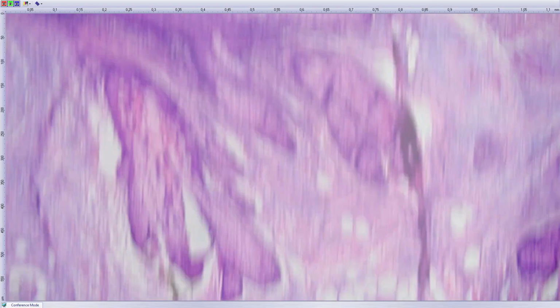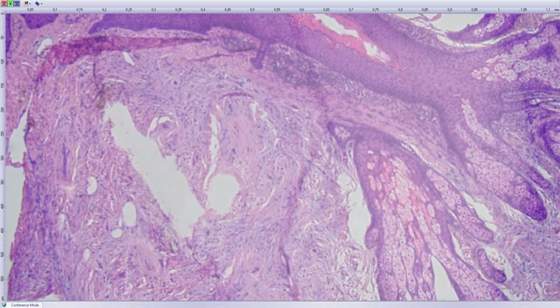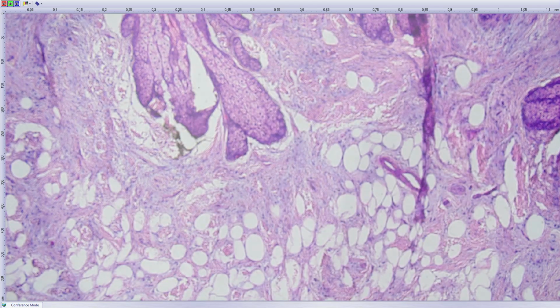But we published with our colleague Kveta, and we recognized that it's only reactive hyperplasia secondary to spindle cell lipoma or fat-free lipomatous tissue. You see very nicely here the spindle cell lipoma around. The name of the lesion is trichodiscoma. Trichodiscoma is a tumor that can arise either solitarily or within a syndrome. But we found that these non-syndromatic lesions are always caused by mesenchymal proliferation, like spindle cell lipoma, like in this case you can see it here.